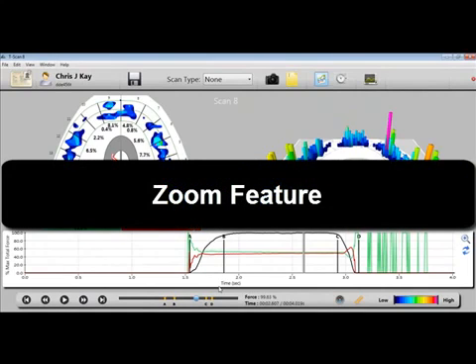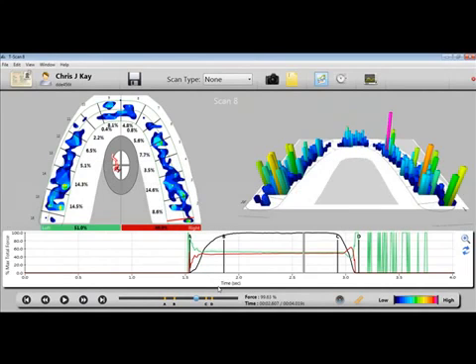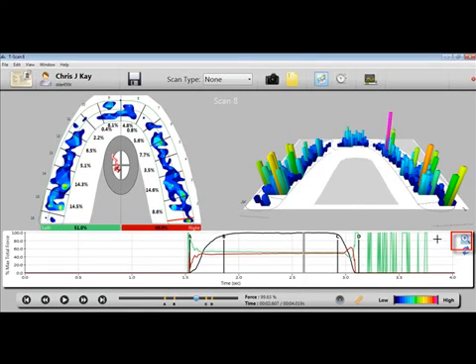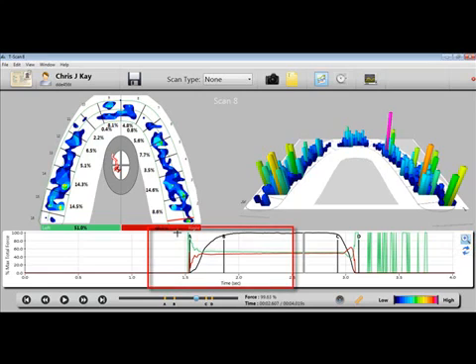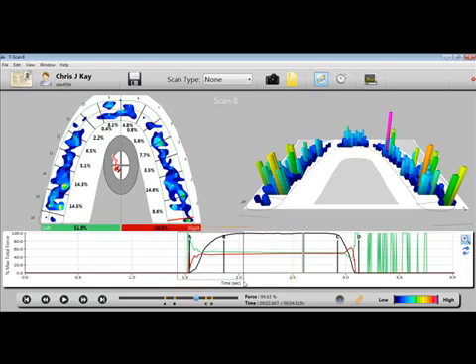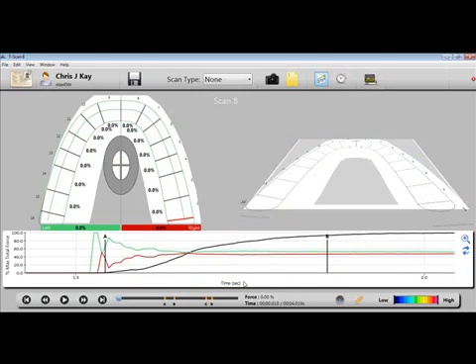Graph Zoom Feature. The zoom feature allows for a larger view of a specific region of the graph. To use, click the zoom magnifying glass icon. The cursor will change to a crosshair. Click and drag to select a region of the graph, then release. The graph will zoom to the selected region.